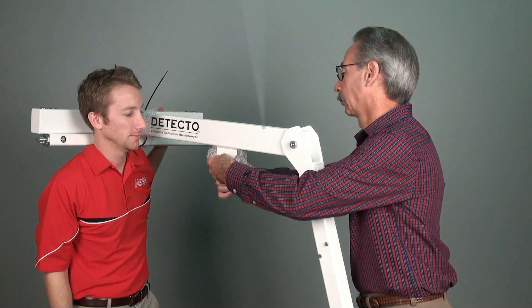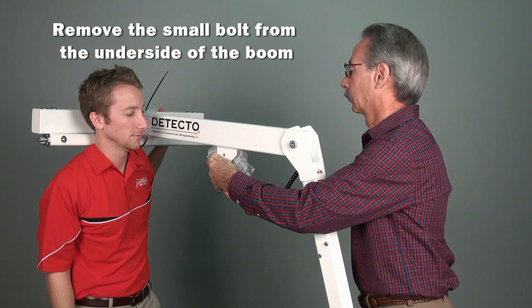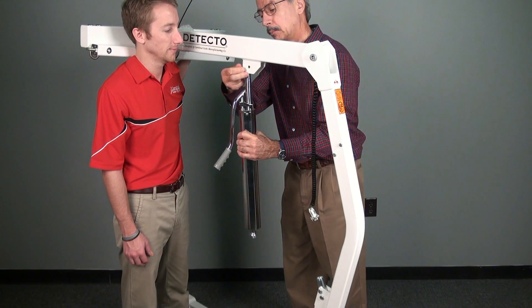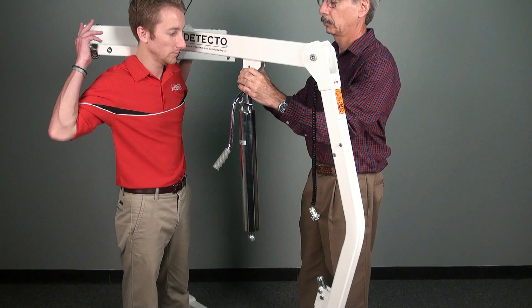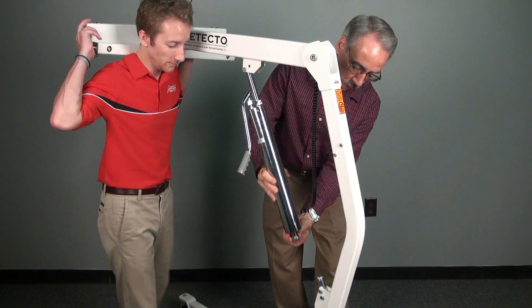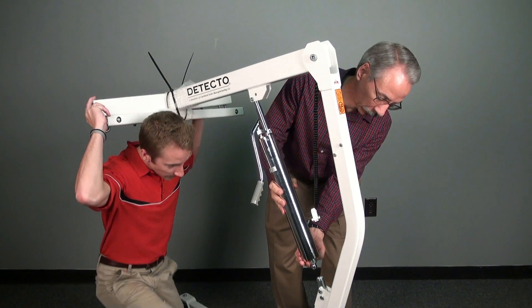Then remove the small bolt from the underside of the boom assembly that is holding the load cell cable in place. This is the cylinder mounting plate where you will connect the hydraulic cylinder to the boom assembly, secured by the same bolt. Note the location of the bolt in the cylinder mounting plate as it must be reinstalled into the same hole. Place the other end of the cylinder into the ball socket located on the column assembly and hand tighten to secure the cylinder in place.